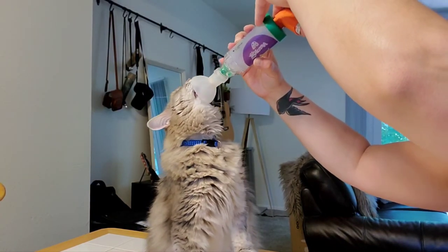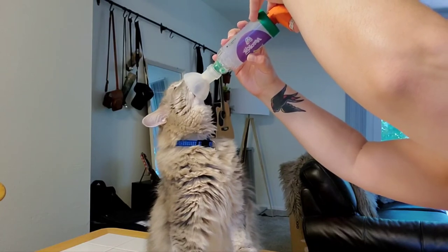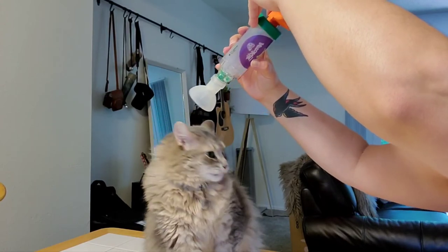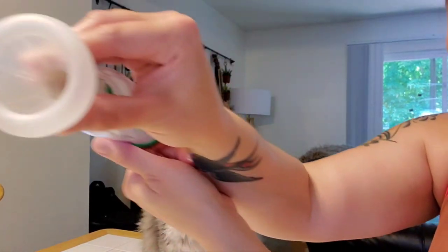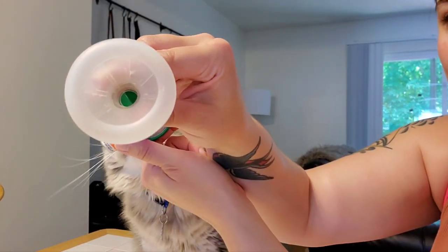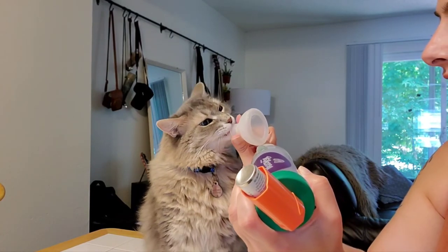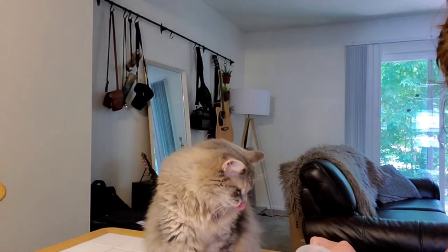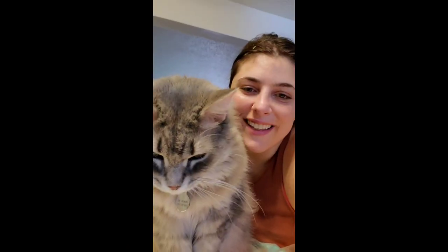There's probably some medicine still in the chamber, so I'm just going to let him lick it up. Good boy. He gets it out pretty well, so there's nothing left. He loves tasties, so I usually let him lick out the rest — kind of clean it up. And I'll give Bebe some of this too. Thanks for stopping by!